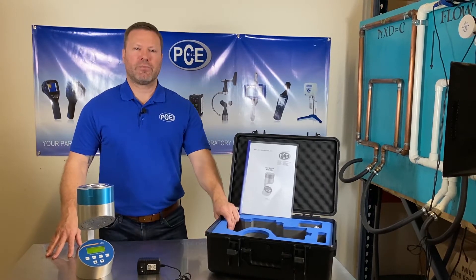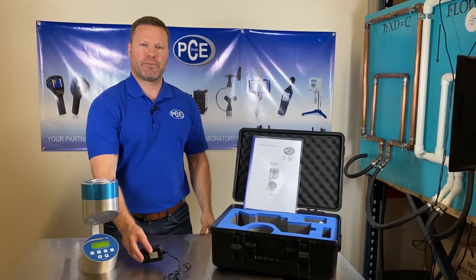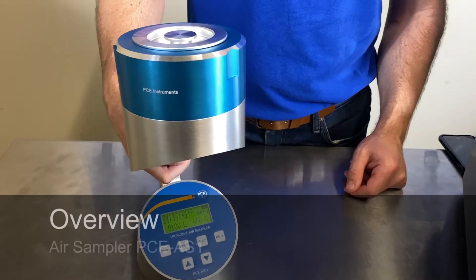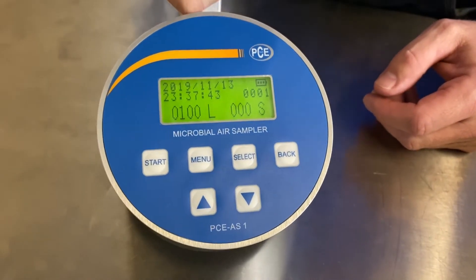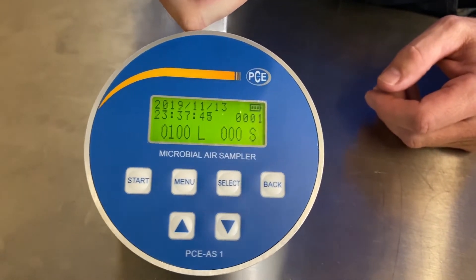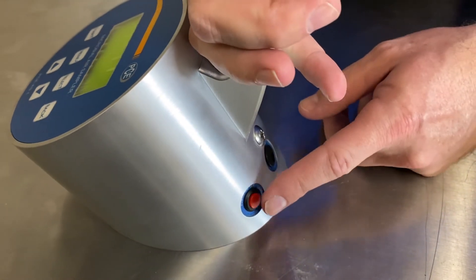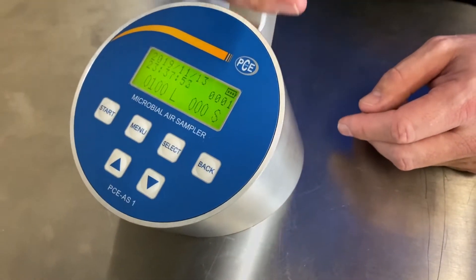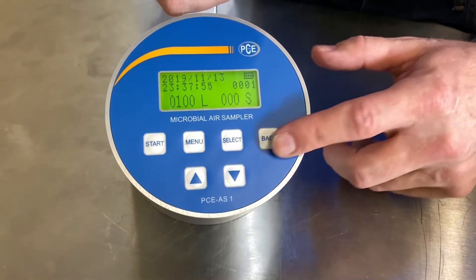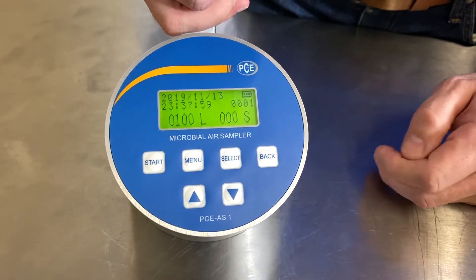It comes with this case here with a user manual and a wall power adapter. As we take a closer look at it, it's a very simple device to use and operate. You've got your power switch in the back here — this is your on/off switch — as well as your input for wall power. And here's your main panel for making all your settings, setting your date and time and your sample length.